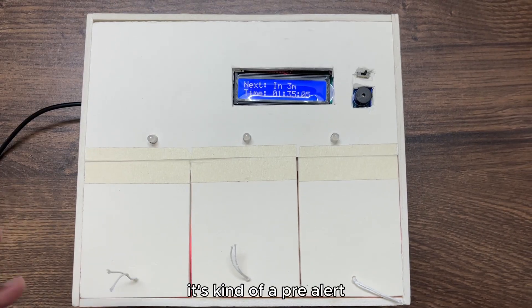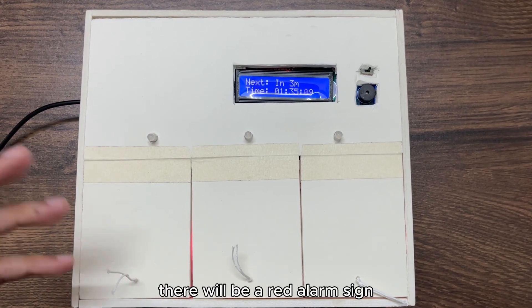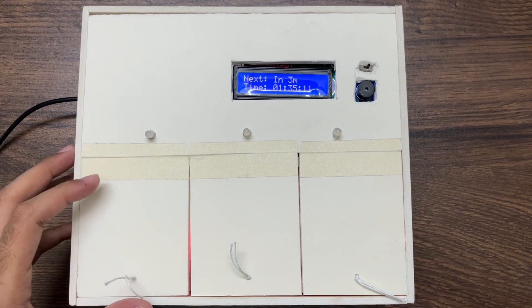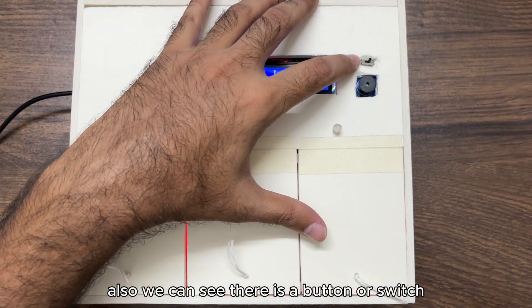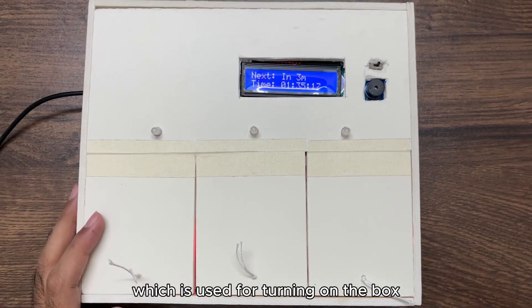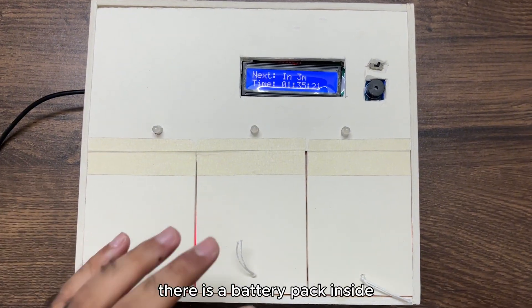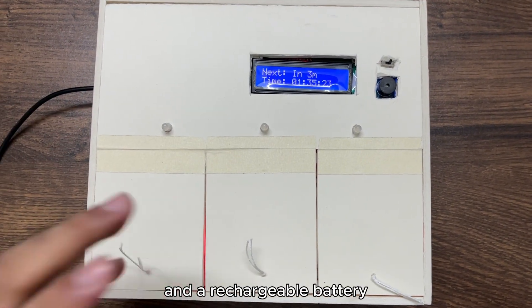It's kind of a pre-alert, and at the time of taking medicine there will be a red alarm sign. We can see there is a button or switch which is used for turning on the box. We can turn this on or off based on the battery. There's a rechargeable battery inside.